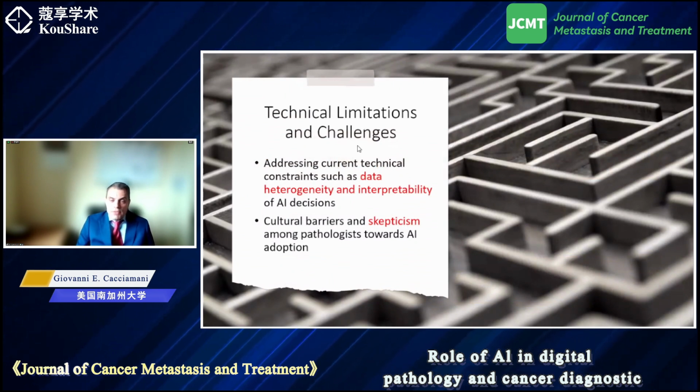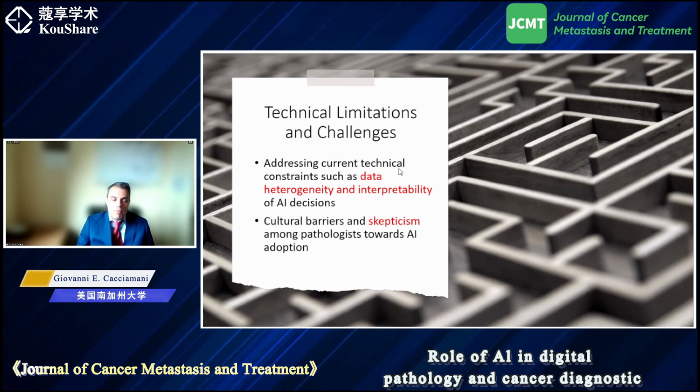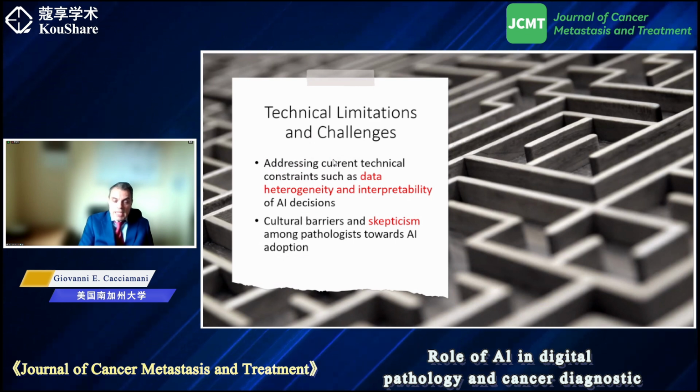The first, as I mentioned, you cannot train an algorithm if you are not a super expert, because you need to train with the best of the knowledge to allow the system to be reliable. And the second point is that for cancer diagnostics, particularly, there is a huge heterogeneity. Also, when comparing studies, which kind of tumors you have studied, the amount of tumor cells, how easy they were to recognize in real life.